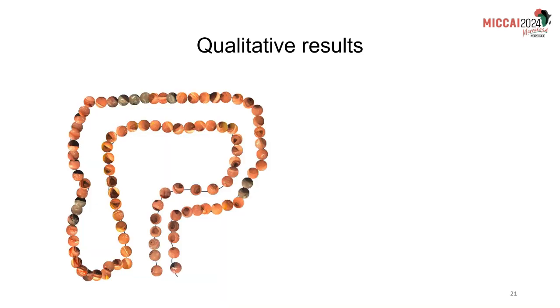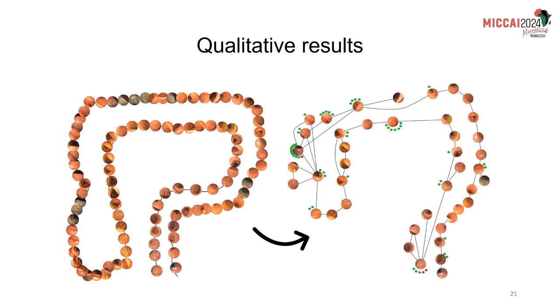So to sum up, we started with this sequence of submaps built by Topological SLAM that represents the procedure in a very simplistic way. And after applying our Colon SLAM algorithm, we're able to build this nice topological graph that better represents the complexity of the procedure, with this rich graph with a lot of traversability edges that represent the back and forth movements of the endoscope during the procedure, and each node representing a colon location with a lot of covisible submaps in it.